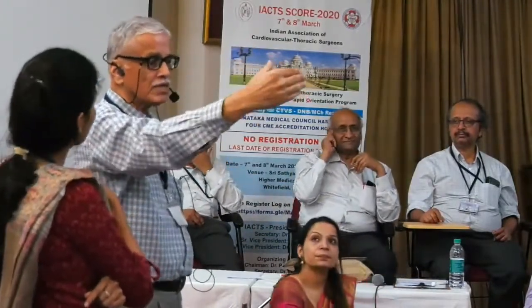Grade one, you got it. But no, root pressure not any. Sir, my own performance: open the aorta and give the selective root cardioplegia. You compress the sub-aortic region. The thumb is in front of the RV and the two fingers go in the circumflex region, the area of the left region. And while doing it, check the aortic root pressure.